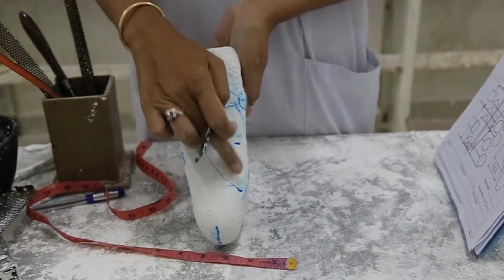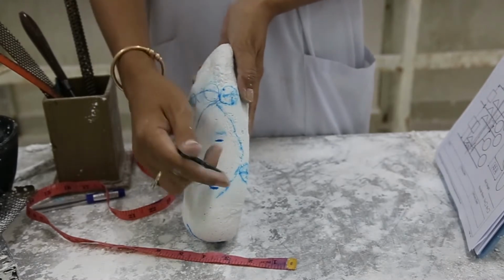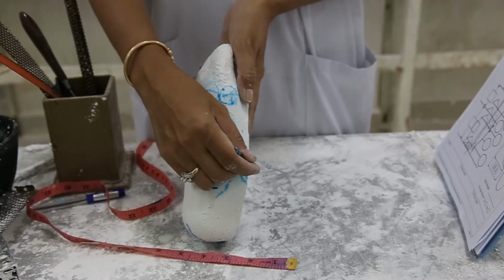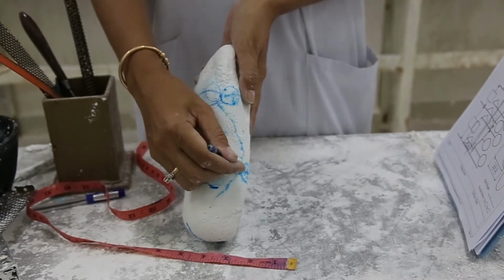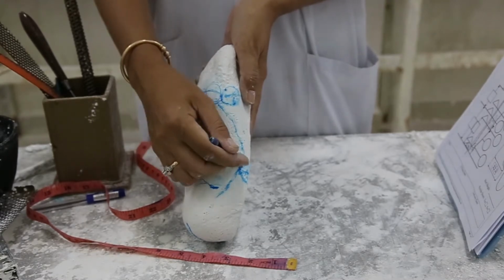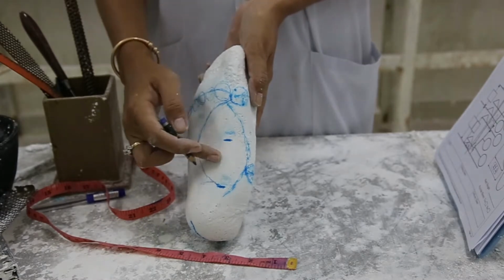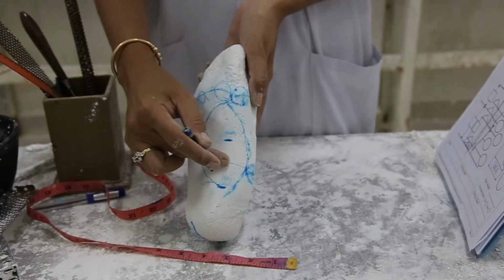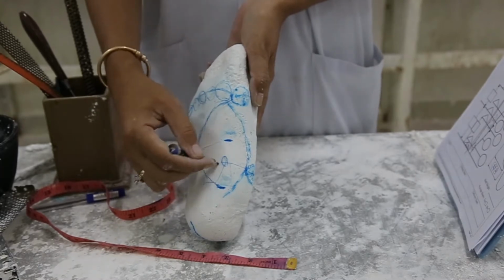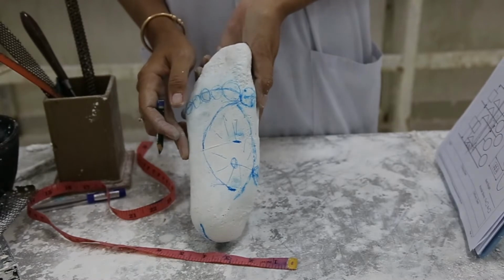So that is the medial arch, and here when you blend it, you just find out where is the navicula and take just distally of navicula, so we just blend it up until there. So that is the highest of the medial arch, so you just get it down. This is the deepest point, and the rest we just blend it. So that is the medial arch.